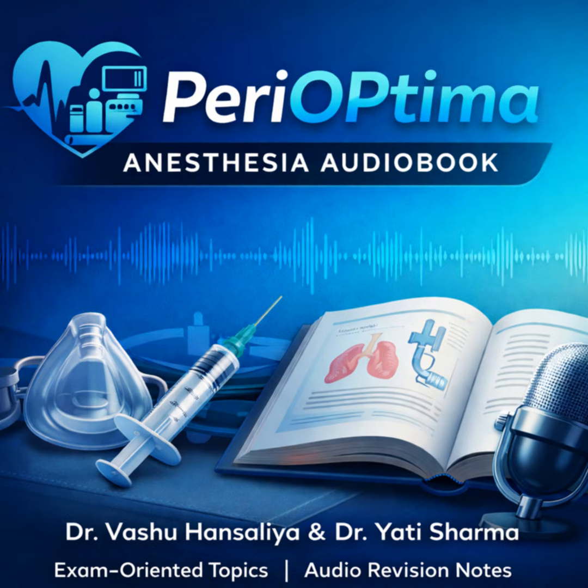Okay, now we have to address the exam critical exception. The case study of the Desflurane vaporizer, the Tech 6 Plus. Why is standard safety engineering not good enough for Desflurane? Desflurane's physics just demand a completely new approach to safety engineering. The challenge is its extremely high volatility. Its boiling point is just above room temperature. It is, just 22.8 degrees Celsius at sea level. So if you used a conventional variable bypass vaporizer, the rapid vaporization needed would cause the liquid to cool down drastically. Cooling effect. Exactly, and that would lower its vapor pressure and cause the delivered concentration to drop off significantly. It would be completely unreliable.